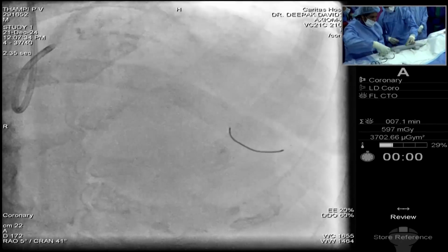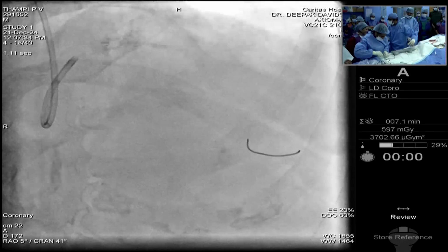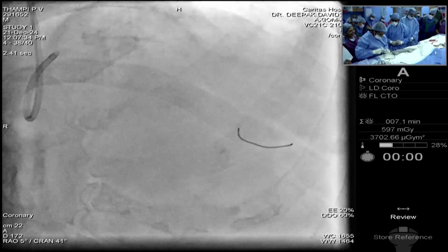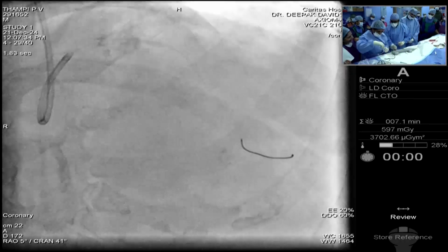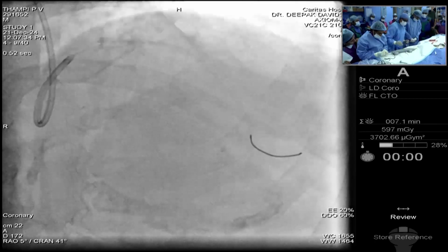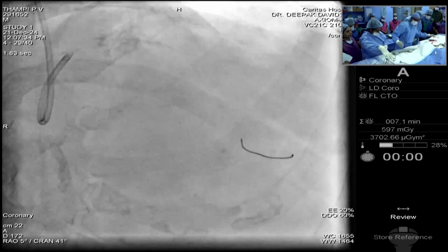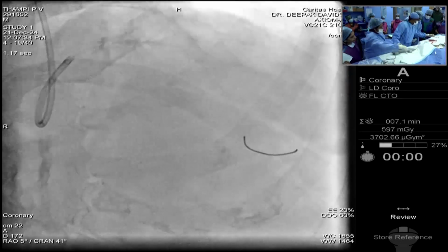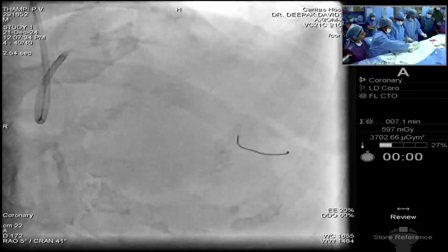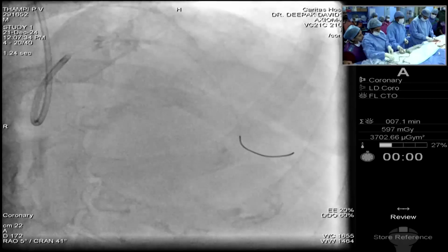This is the open position. You can move forward. Basically, it's like you're opening the wings, ready to fly. That's how they say about it. Easy to remember. Now we locked it. We have kept the toggle button at 80,000 RPM, and we'll see. Always when you want to check it, keep it away from the drape. Okay, it's working. So now shall we go in? Okay.